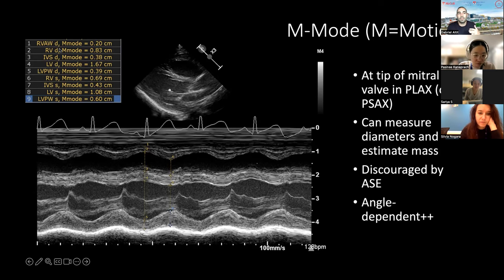And there are many algorithms and markers that put these things together to calculate, for example, ventricular mass. Or you can use some of the normative data to look at whether my posterior wall in diastole is thicker than it should be for the age of my patient, to tell me if this patient has some degree of hypertrophy, like cardiomyopathy or hypertrophy secondary to iatrogenic exposure to steroids, for example, or infant of a diabetic mother, who typically get more septal hypertrophy, and typically the septal hypertrophy is more concentrated here. So that's why I'm saying sometimes the M mode is not so great, because you may not have homogeneous changes to your heart, and that might not be picked up by the M mode. Make sense?